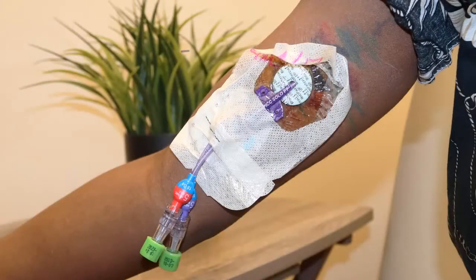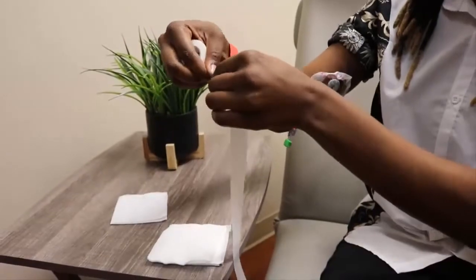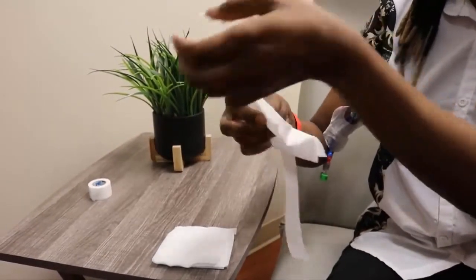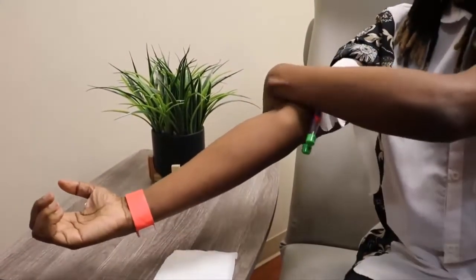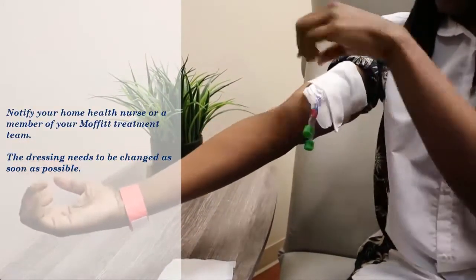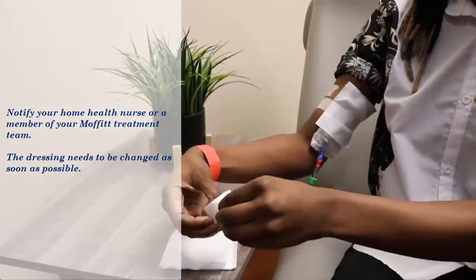The PICC dressing must be changed every seven days, or more often if it becomes loose or soiled. If your dressing does become loose or soiled, do not remove it. Place a clean gauze pad over the existing dressing and tape the new gauze into place. Then notify your home health nurse or a member of your Moffitt treatment team so that arrangements can be made for the dressing to be changed as soon as possible.